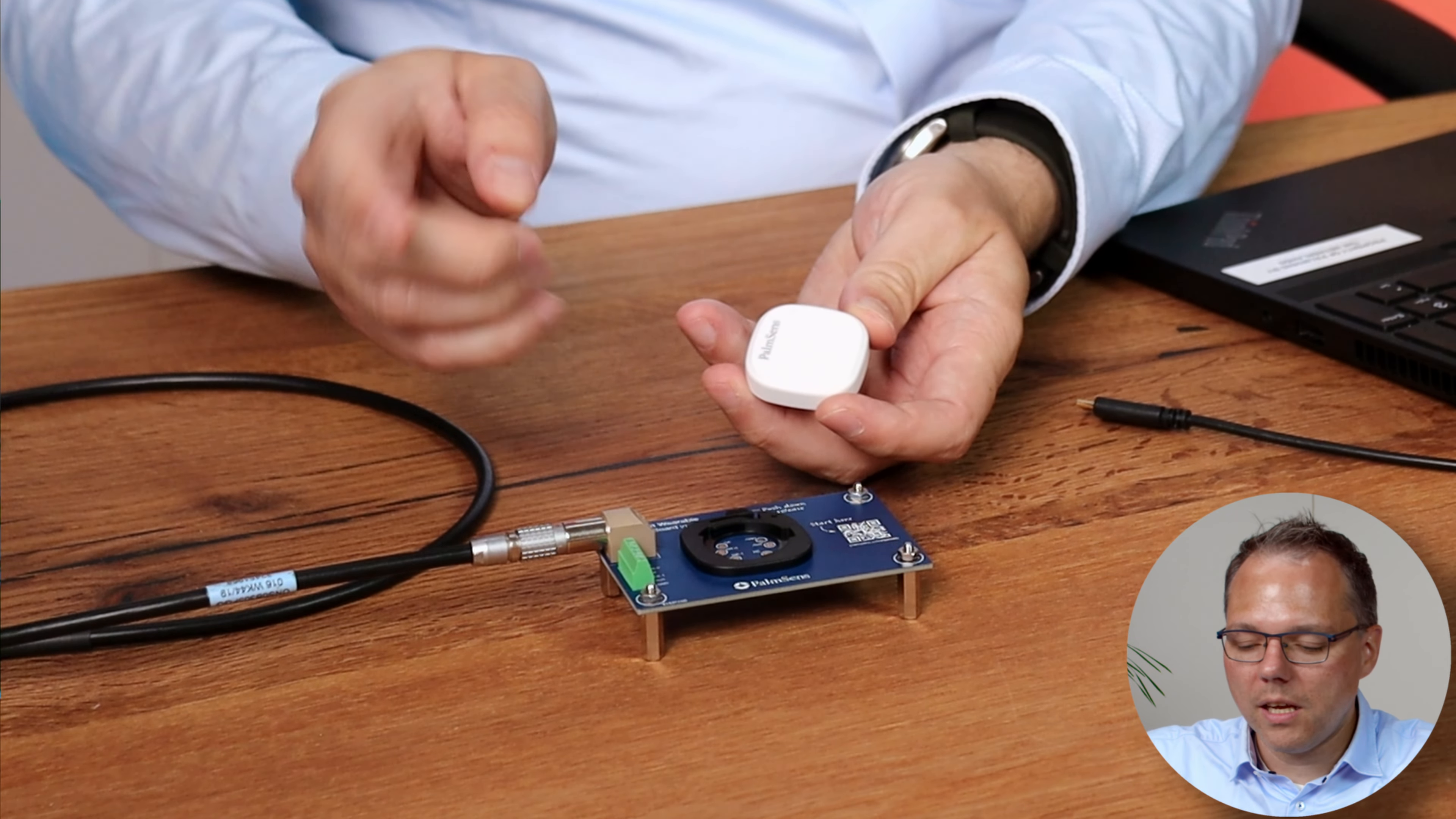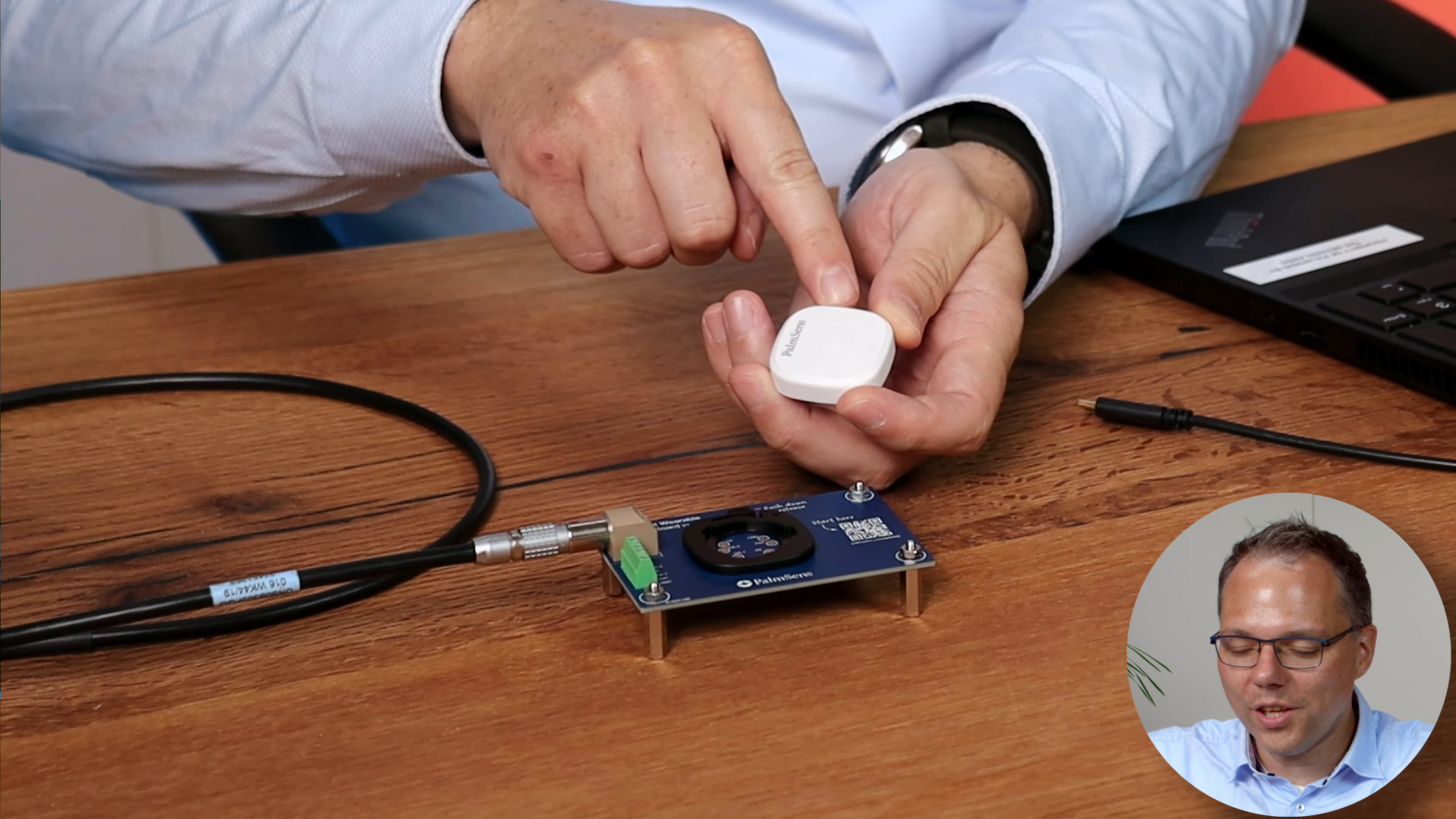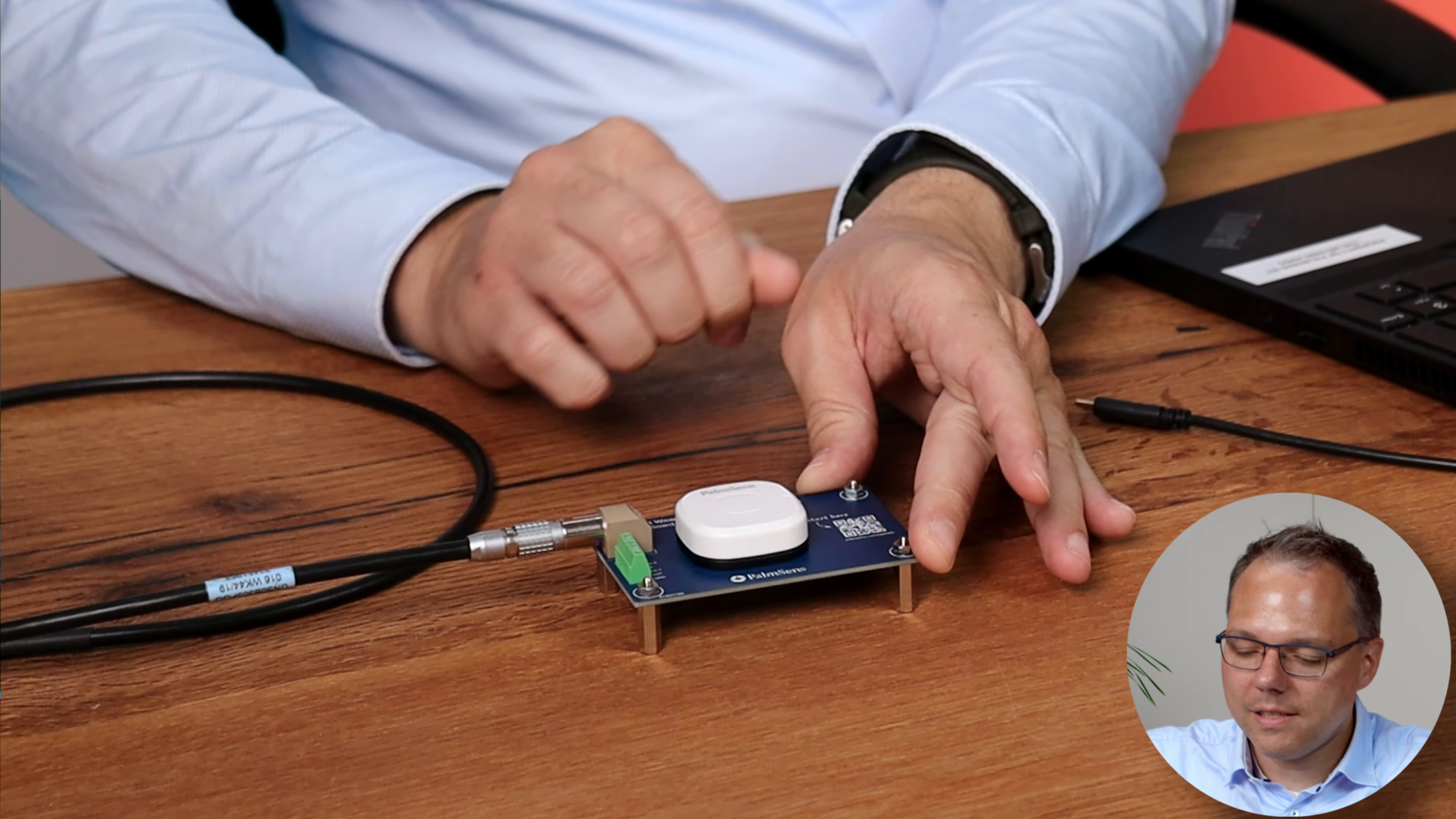On this breakout board I will now mount the Sensit wearable. To do that it's very easy you just look for this dot on the mounting bracket and you look for the dot on the Sensit wearable. You align them and then you turn the Sensit wearable 45 degrees clockwise.